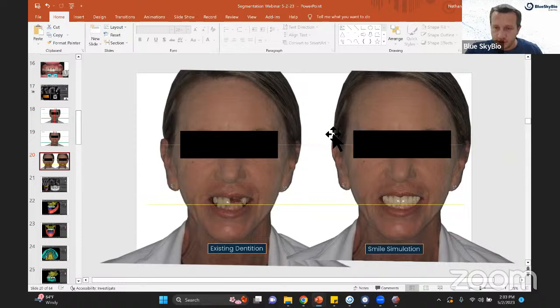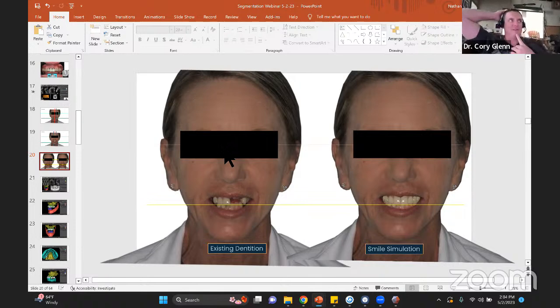So Jason Larkin is commenting, Dr. Jason Larkin, spray face with contrast pattern during CBCT scan maybe, or using an intraoral scan to do the face scan with dot stickers on the face. Okay, so those are suggestions as well. The spraying their face with powder is a tough sell, especially for females with makeup on, as you might guess.